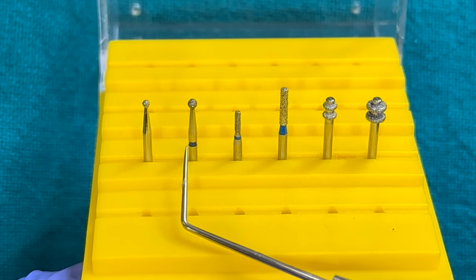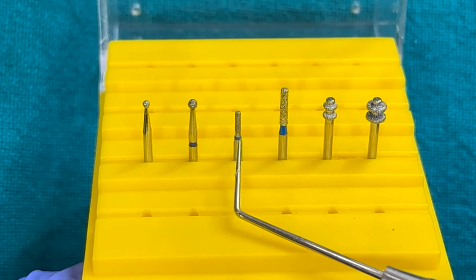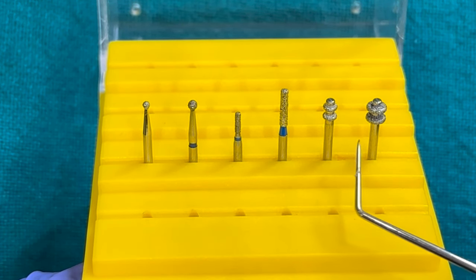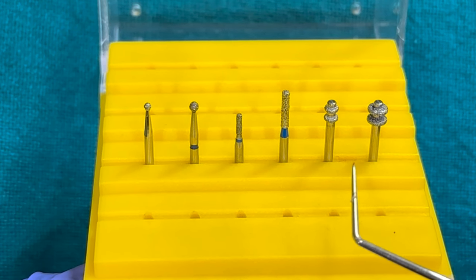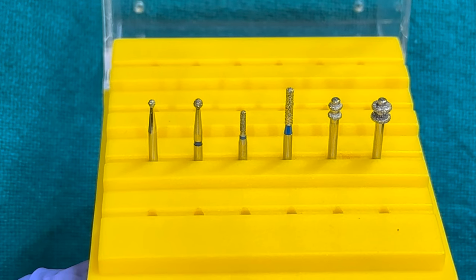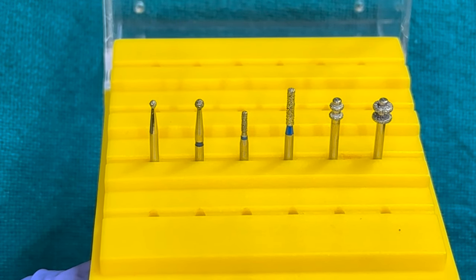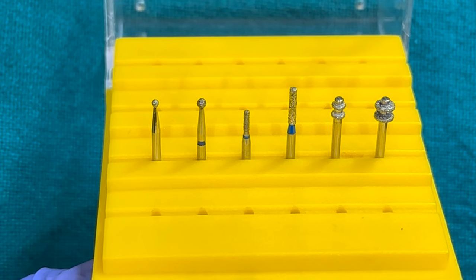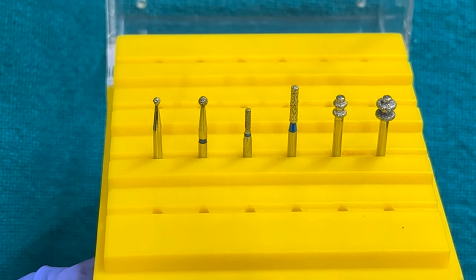These are round burs, straight burs, and depth cutting gouges. All these burs, either individually or in combination, are used to create depth cutting grooves on the surface of the tooth. These grooves are especially useful in controlling the amount of tooth structure that needs to be removed.